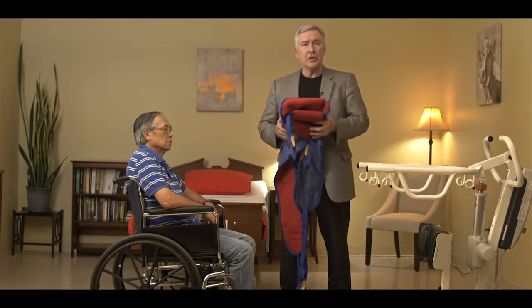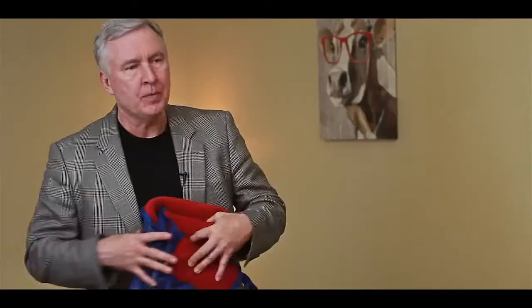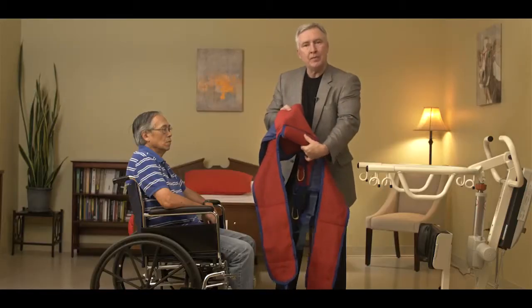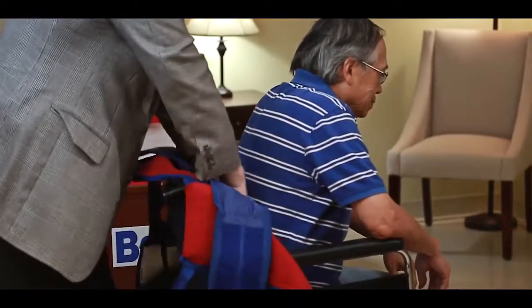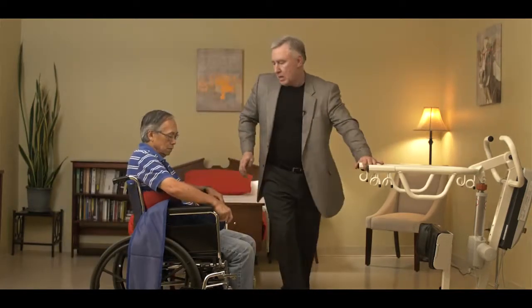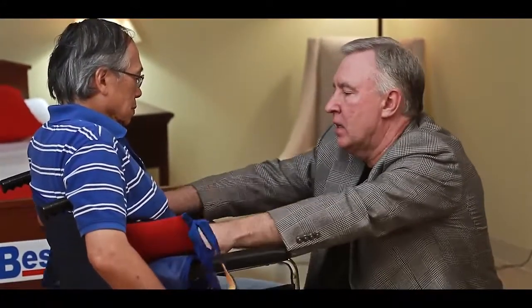Now it's time to show you how to use the Sani sling with the SA family of products. There are times where a patient gets to the point where they need complete and total support to be transferred from the bed, chair, or toilet. Our Sani sling provides the ability to completely support that patient and still get them to the toilet. The sling itself is shaped like a horseshoe, with a strap in the center to buckle around the person's waist and a lumbar support piece. Hold the horseshoe upside down, step behind the patient, tuck the lumbar support down to the lumbar area, bring the waist strap around the person's waist, tighten it, and buckle it. Make sure it's snug.